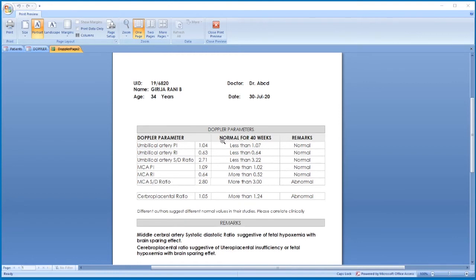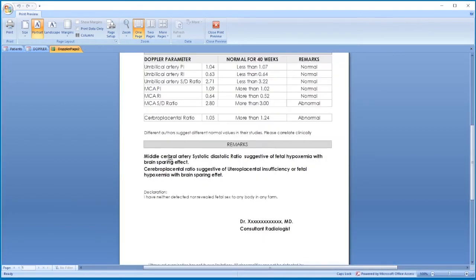This patient is 40 weeks pregnant, so the normal values for 40 weeks are printed here. If it is 35 weeks of pregnancy, the normal values for 35 weeks are printed automatically. The marks are auto-generated. If any parameters are abnormal, they are reflected here. The MCA S/D ratio is abnormal here, so the report reads: middle cerebral artery systolic-diastolic ratio suggestive of fetal hypoxia with brain-sparing effect.